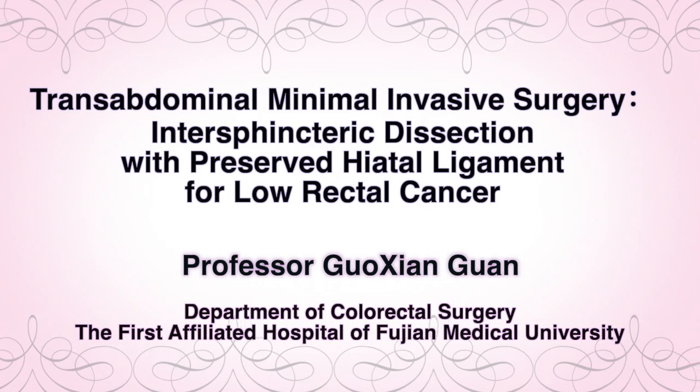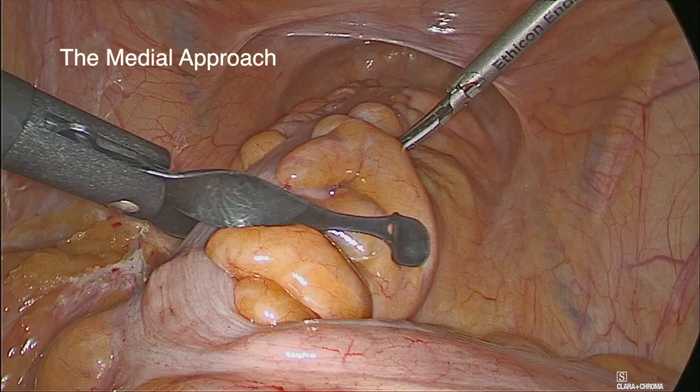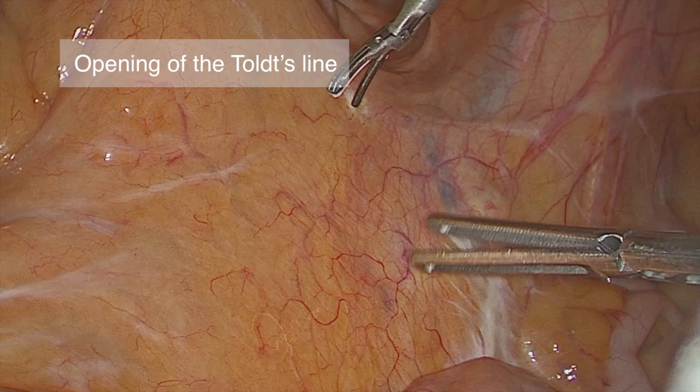Here, we're demonstrating the procedure of intersphincteric resection with preserved hiatal ligament under laparoscopic control. The patient was a 68-year-old male with T3 low rectal cancer located 5 cm above the anal verge. Gently grasp the superior rectal artery to expose the anterior layer of the mesentery, where an incision is made.